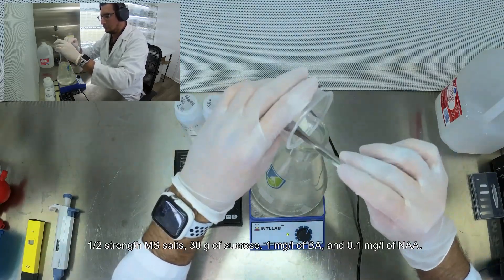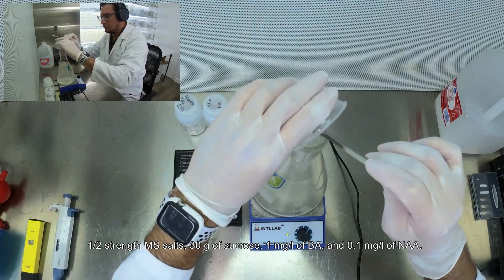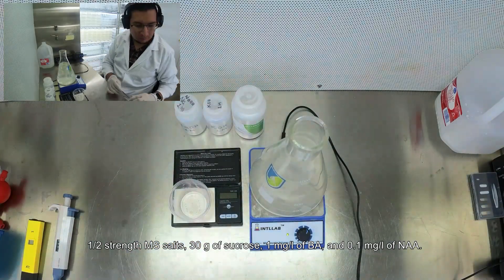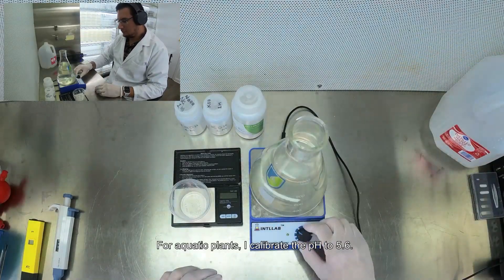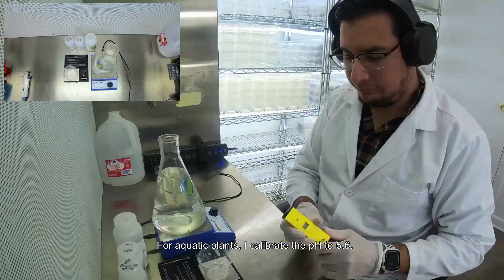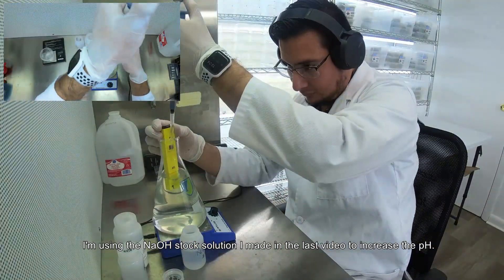Half-strength MS salts, 30 grams of sucrose, 1 milligram per liter of BA, and 0.1 milligram per liter of NAA for aquatic plants. I calibrated the pH to 5.6 using the sodium hydroxide stock solution I made in the last video to increase the pH.